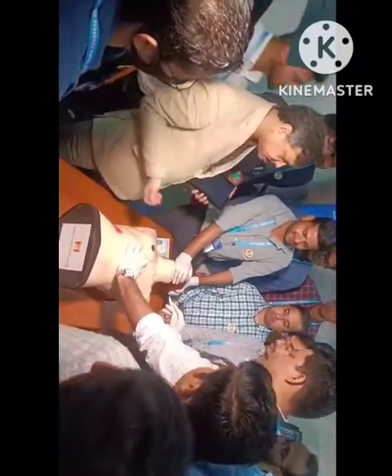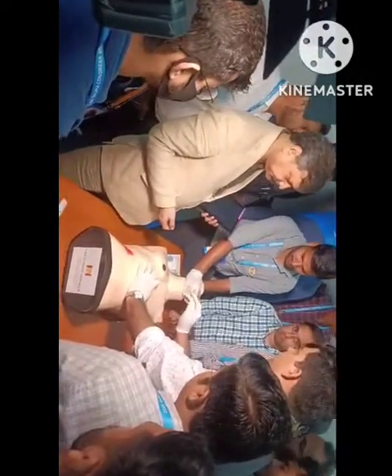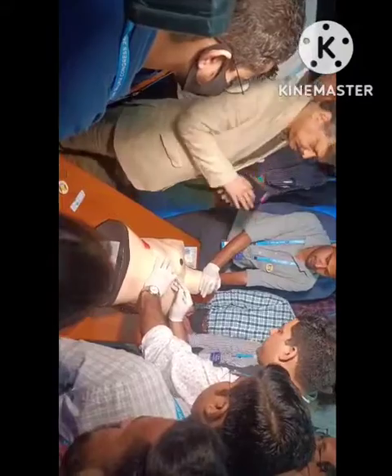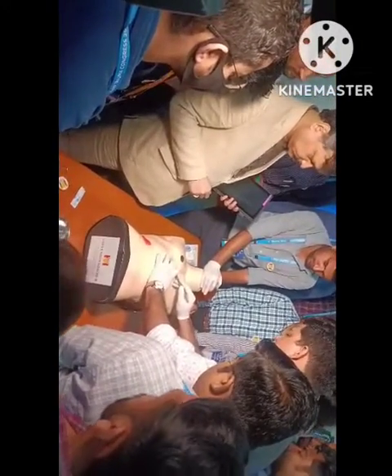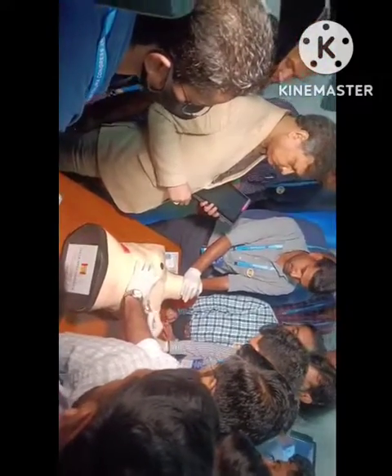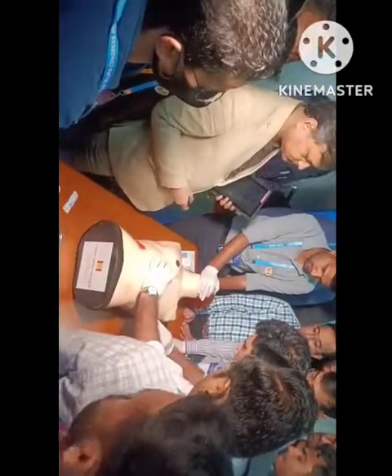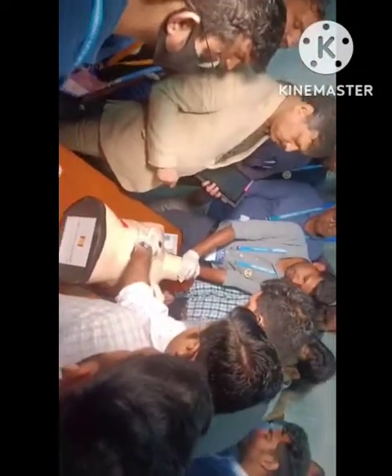Okay, so we are starting. I will go with 2 or 3 steps. I will reach that space with 2 or 3 swipes or incisions. Go up to axilla. We assume that the hand is like this. So you have to take 2-3 swipes. You have to incise 2-3 times. Then only you will go.